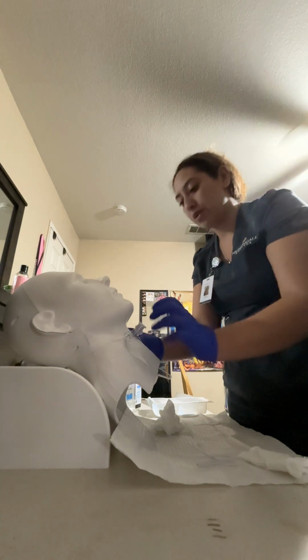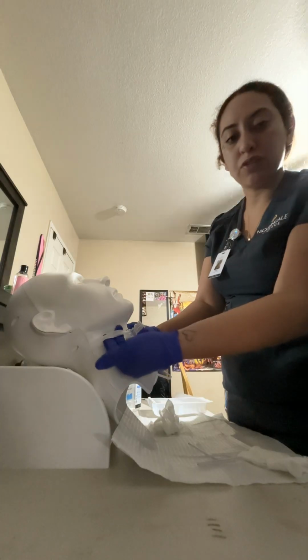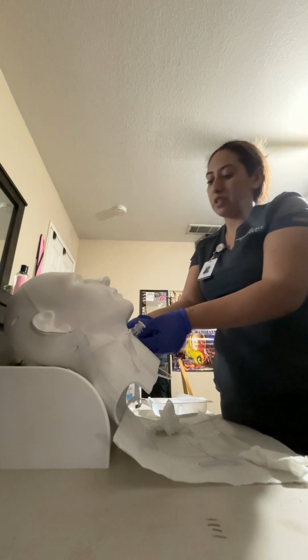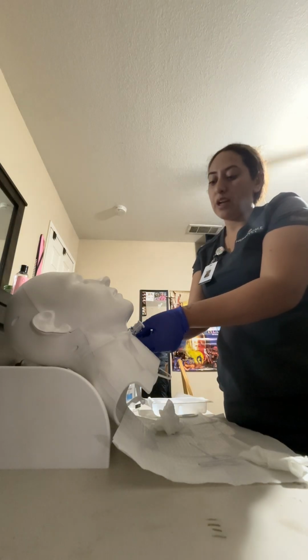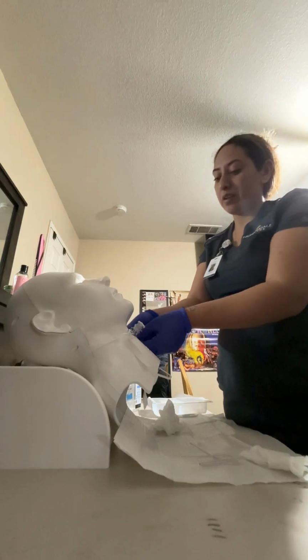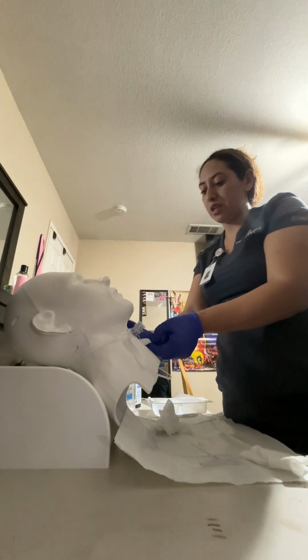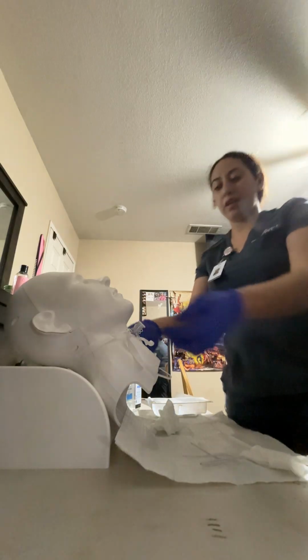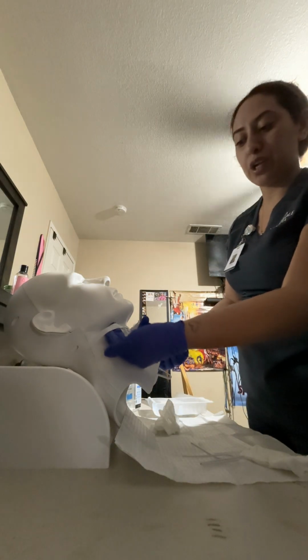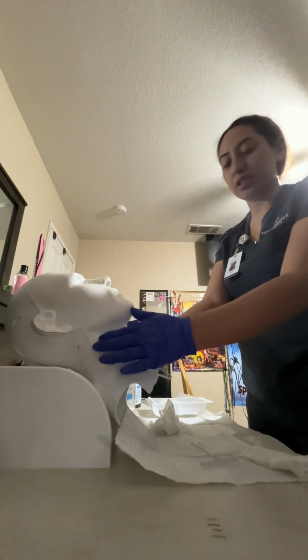And I'm going to assure that I have at least enough space for about 2 fingers here. Have good enough space. I'm going to assure on this side, I can also fit 2 fingers here on this side. I'm going to tie my patient's knot. And I'm going to double check here, 2 finger spaces here, and the dressing is not too tight.